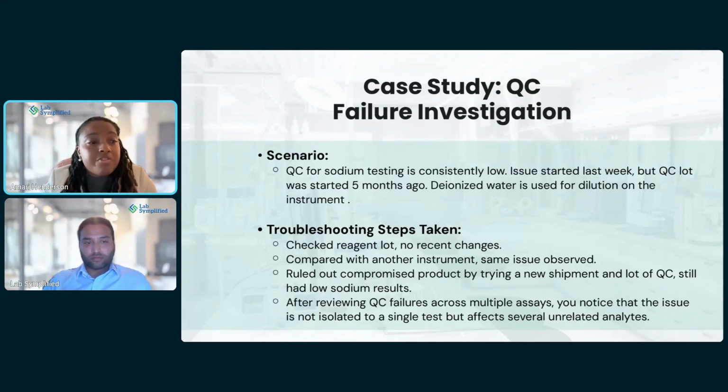Sometimes if your SD is a little too tight, you can call your quality control manufacturer, sometimes even your instrument manufacturer that provides your assay. You can ask them, do you have peer data? Because I want to see what the SD values are for other customers. Is my SD value a little too tight? And again, this is information you can find in your assay instructions for use.